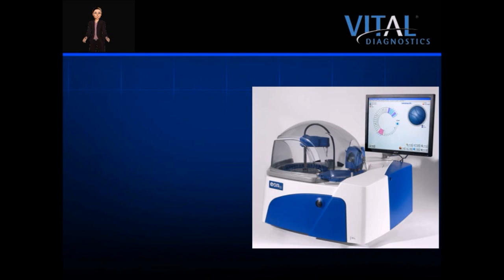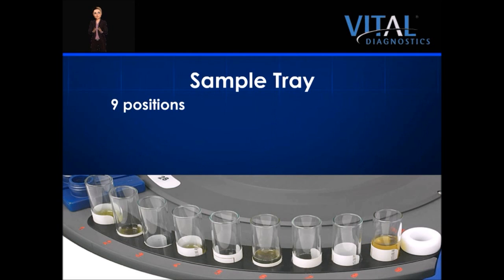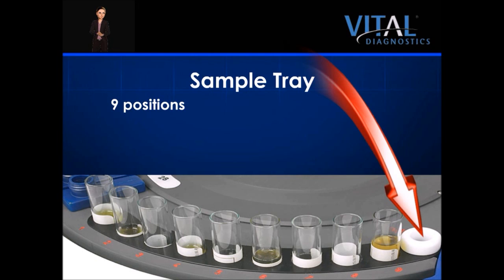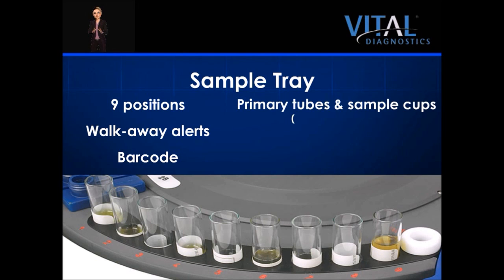The EON100 is capable of performing 180 tests per hour with ISEs. Vital Diagnostics reagents have been approved for either serum or plasma testing. There are nine sample positions located for easy access in the sample tray at the front of the analyzer. The final position in the sample tray is the access port for the ISE module. Samples can be continuously loaded, and alerts on sample status afford the operator extended hands-off time. The system utilizes a barcode reader for primary sample tubes for positive patient identification, and barcodes eliminate data entry error and help decrease processing time. The system accepts 12x75 and 13x85 mm primary tubes with 3 or 5 ml draws, or EON sample cups for low volume samples. The system accepts stat samples at any time.